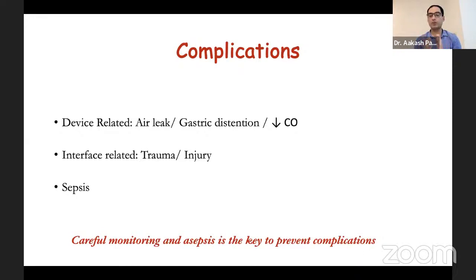Another important and common complication is related to the interface, that is nasal injury and nasal trauma. So the best thing to avoid this is to use a mask, and during each shift, you should remove the mask. If there are signs of redness or blanching, you should gently massage the nose to relieve the tension on the nose, and always be meticulous in using CPAP. Just like any other procedure, this can also lead to an increased risk of sepsis.